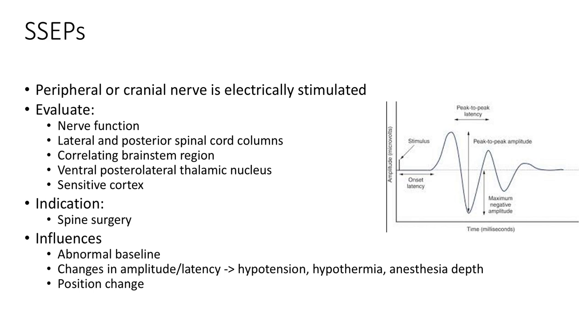Sudden changes in anesthesia depth is a major influencer of the value of EP monitoring. So therefore, whenever you're an anesthesia provider with evoked potential monitoring, you should strive for steady state, and anytime you have to bolus anything, you need to communicate that to the neurophysiologist monitoring your evoked potentials.